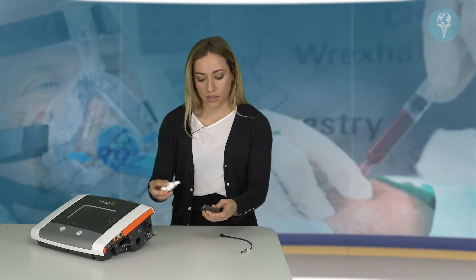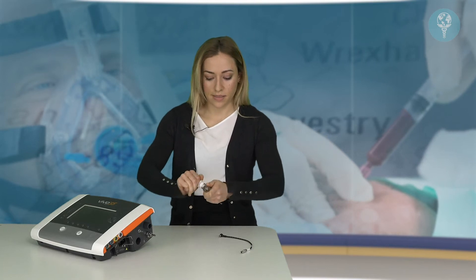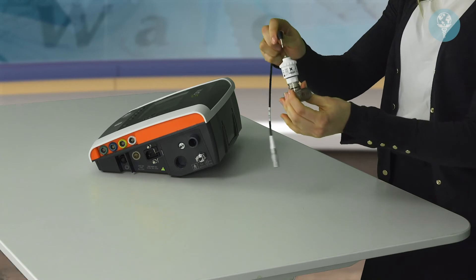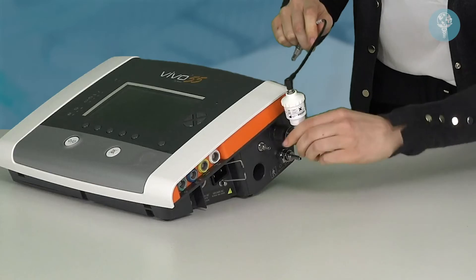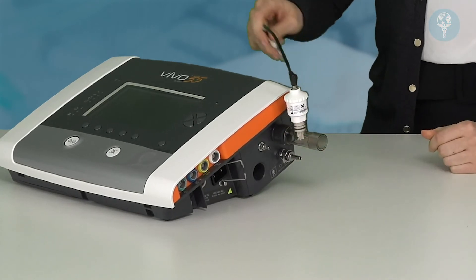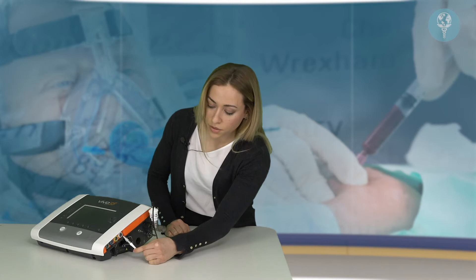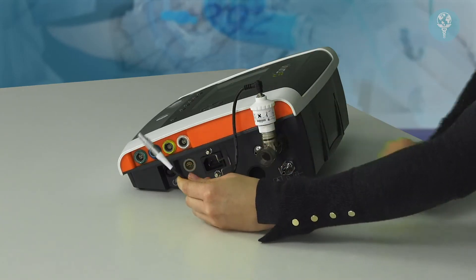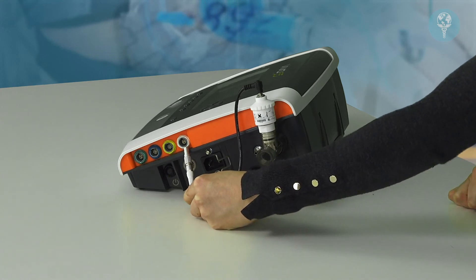When you first put them together, put the sensor into the top of the T-piece. The cable then goes into the top. The T-piece then connects to the patient outlet, and then we attach the sensor cable into the FiO2 socket on the side of the device. The end of the cable is coloured white and it lines up with the white outlet on the side of the Vivo 55, so you know which one to plug in.